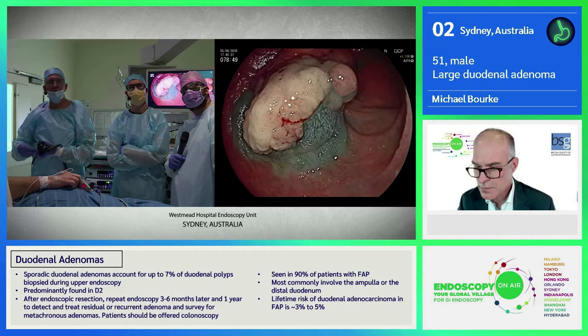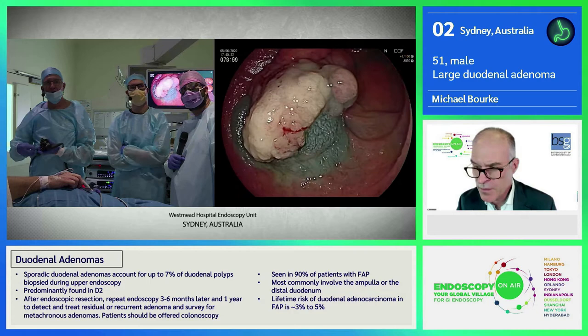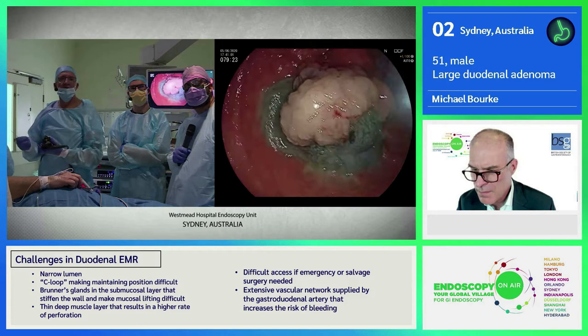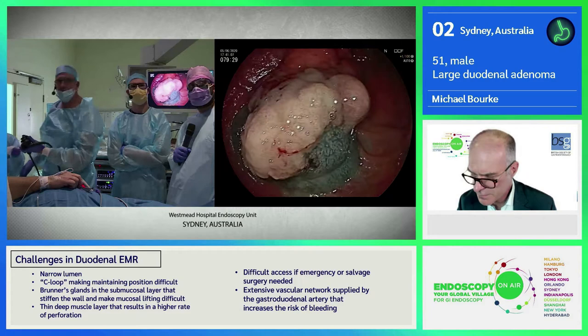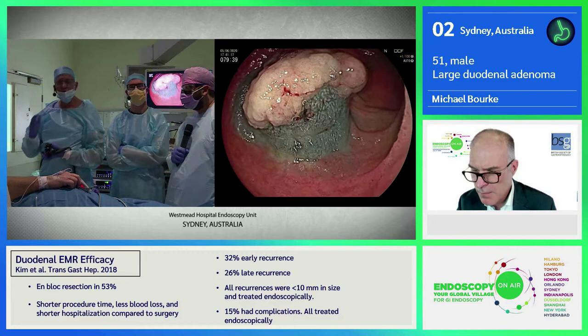So we'll put some lift up as well, and then we'll proceed with, this is a bulky lesion. So if it was flat, we'd do cold snare excision. If they're less than 4 centimeter, we're doing the same thing with our FAP patients, needle back, that's fine. Let's have the snare, let's have the 15 captivator. So the cold snare excision in the duodenum for the FAP patients has been a lifesaver. You can control the burden of the disease with absolutely no risk to the patient.